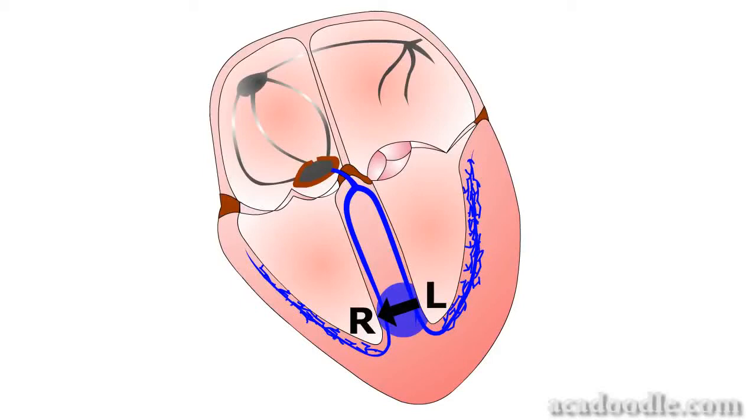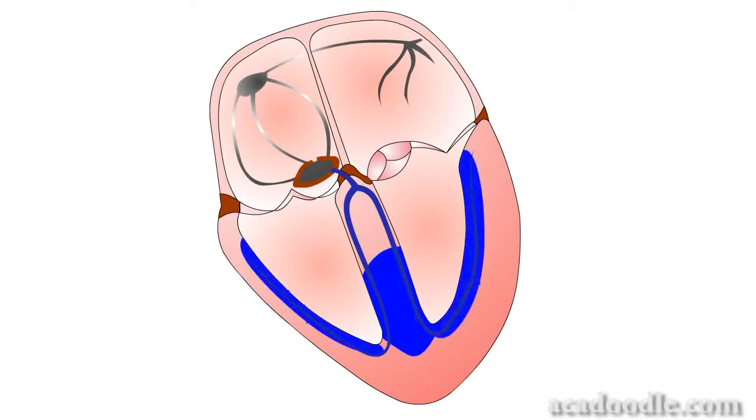important ECG abnormalities. As septal depolarization is taking place, the depolarizing wave is released from the conducting system into the main mass of the right and left ventricles. As you can see here, the depolarization wave is initially released from the terminal branches of the conducting system into the subendocardial portion of the ventricular myocardium.